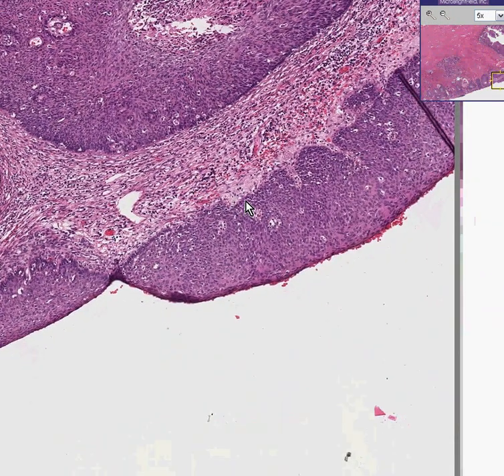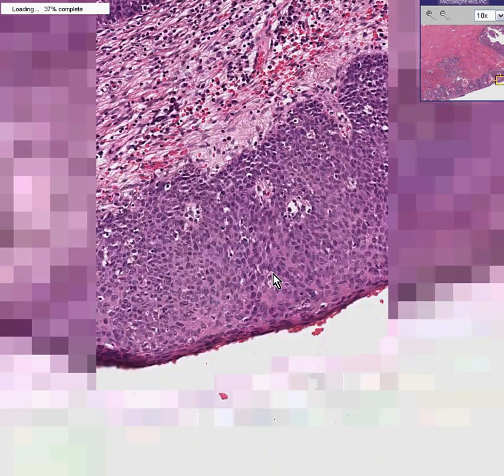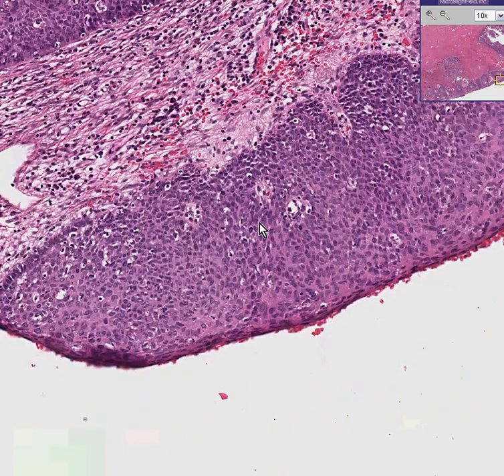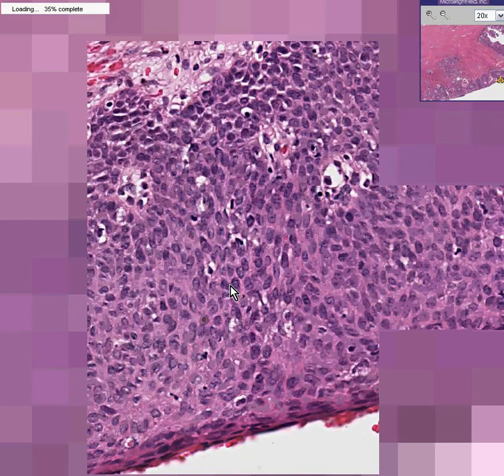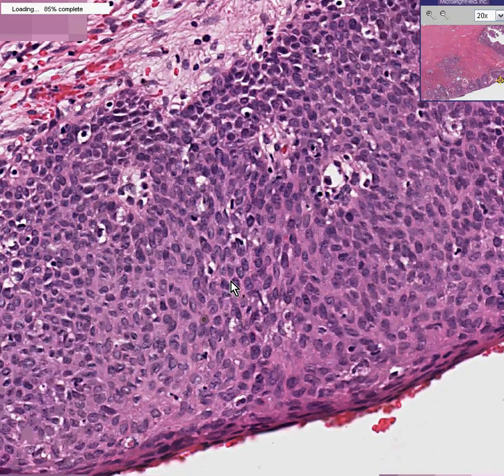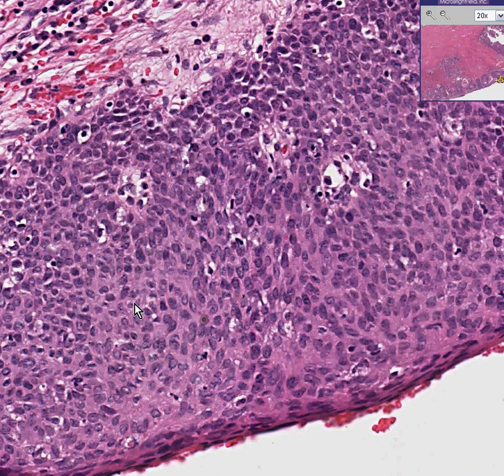We have no maturation from the base to the surface. Instead, all the cells are dark, irregular cells, very much with a high mitotic rate, pleomorphic, hyperchromatic — classical appearance for squamous cell carcinoma in situ, in which this area at the base looks no different from this at all.